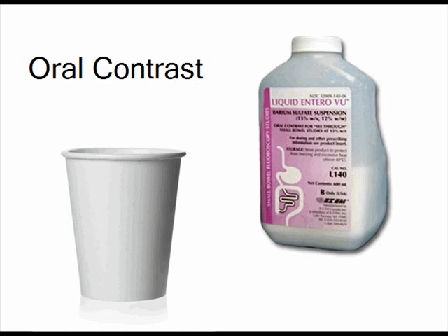No matter the type of contrast used, the patient will ingest the contrast, so the technologist should have a few cups on hand. The radiologist will decide on the amount of contrast to be given to the patient, and that amount should be ingested by the patient as quickly as possible.